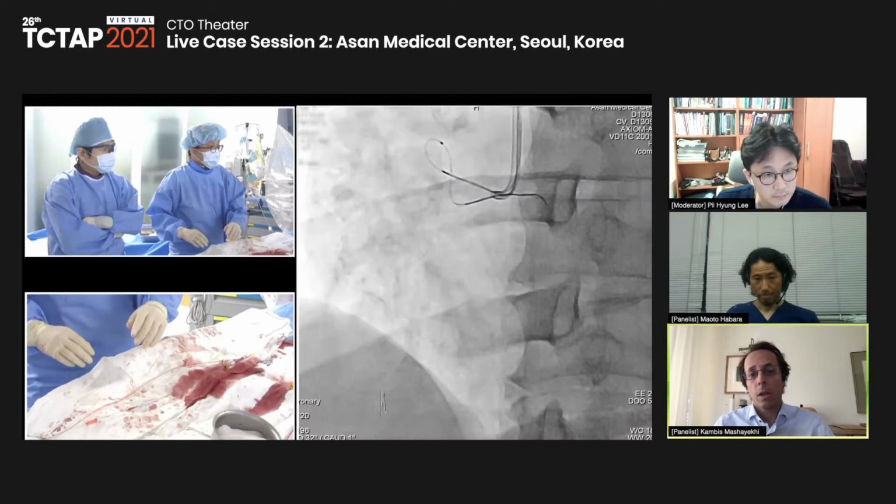So regarding the puncture, if you do a very good puncture at the proximal cap, what we have seen is that there seems to be not too much calcification. So I think if you really do an IVUS controlled puncture and you make the puncture perfectly, probably step down regime and channel tracking or intraplaque tracking will be successful.